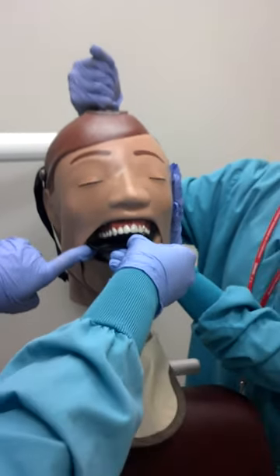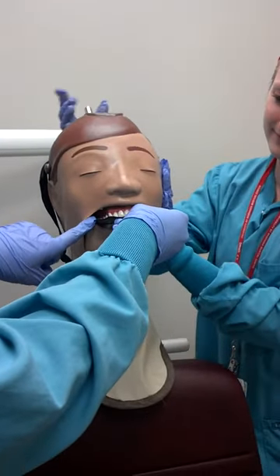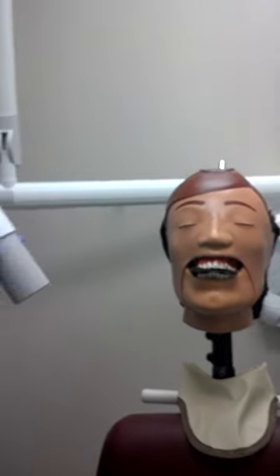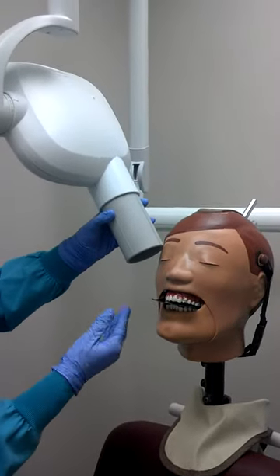Have the patient bite down gently with no further movement. You want the central ray aimed with a vertical angle of about 60 to 70 degrees and a horizontal angle of about 90 degrees.